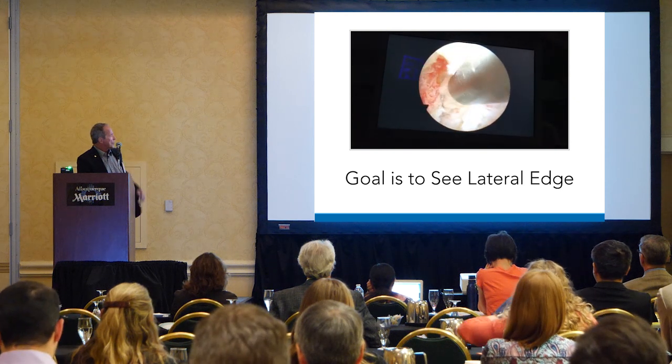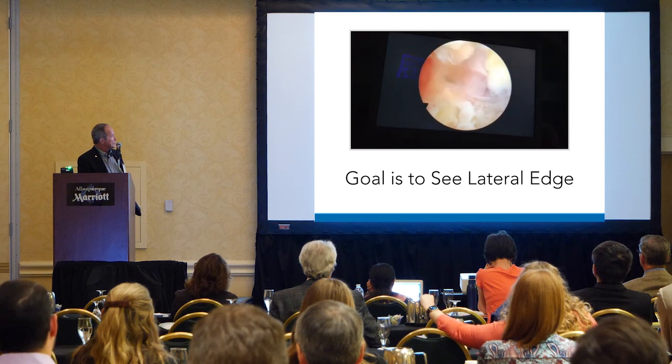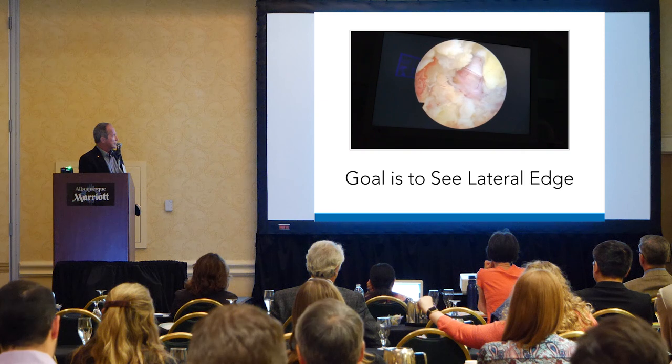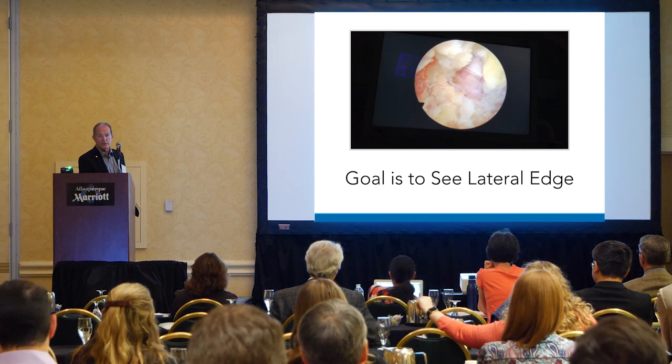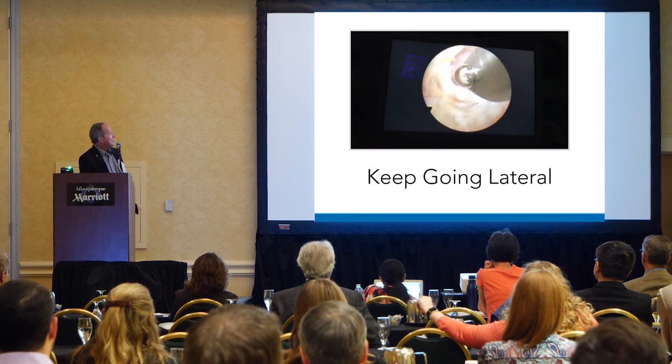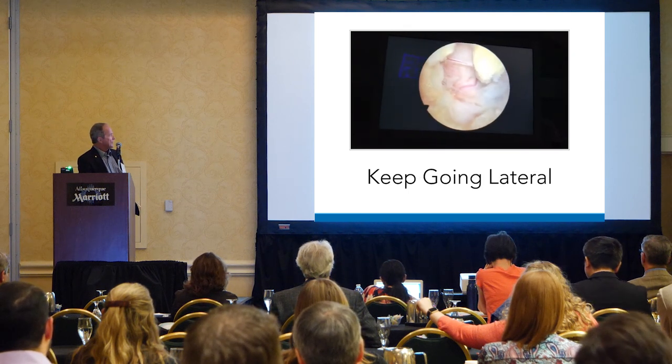Now we're just going a little bit more lateral so we can find the exiting nerve root, which we're going to see in a second. But there is the lateral edge. That means you've gone far enough lateral to at least get started with. You now can look for the exiting nerve root. Keep going lateral, because now we're going to look for the exiting nerve root.